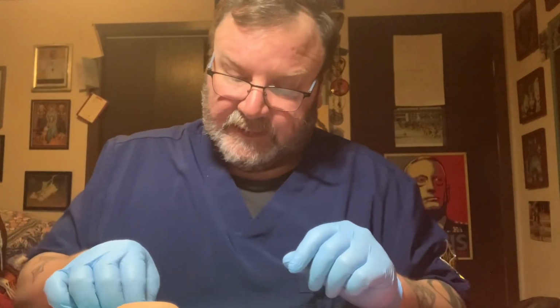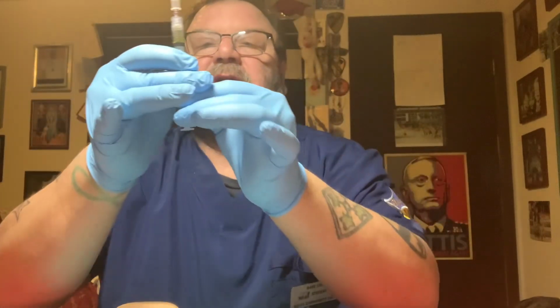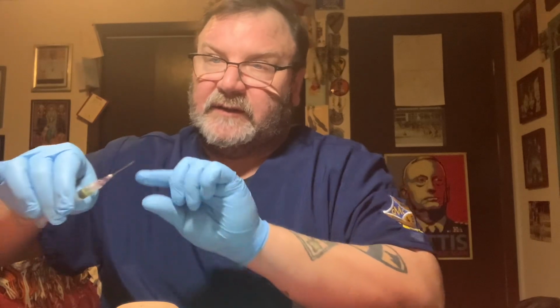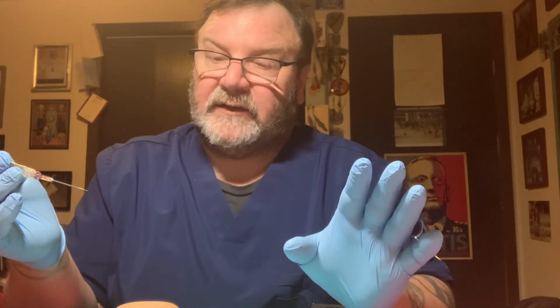Once I had that done, I would take my syringe with the medication and air. Never hurts to verify one more time. Against the MAR, medication, third check, double OK method, out. This needle is not appropriate, but I have equipment limitations, so I would use the appropriate needle, but this is what I've got that will work with the syringes in our kits.